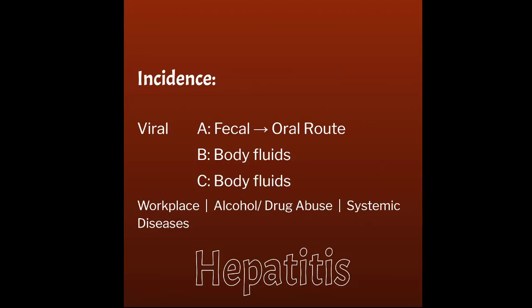And what we're kind of seeing now, there's a lot of older Americans that have hepatitis C due to lifestyles from the 70s, and now we're seeing them on our tables with this hepatitis in advanced stages of it. So it's actually probably my most common thing that I see, hepatitis B and C, just for follow-up livers. We scan them every 6 months just to take a look at what their liver is doing.